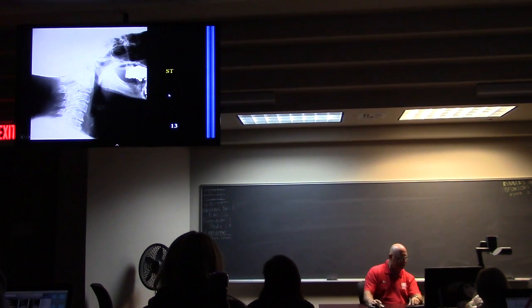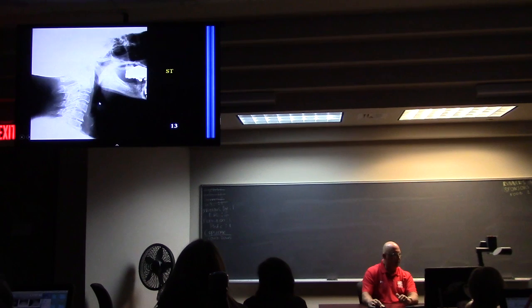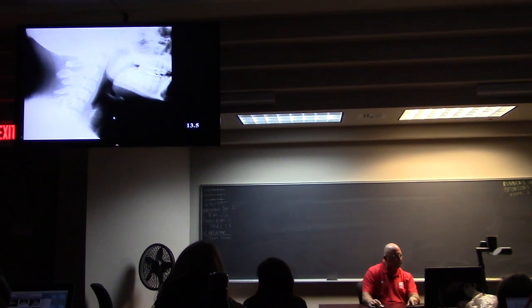Oh, I'm so sad we can't see this. This is a 70-something-year-old lady who came in with a sore throat. She had epiglottitis. You follow the tongue back to where it stops, and right there is a big thumbprint. It's really beautiful. I can't see it on my monitor. Can you see it? Yeah, vaguely. Yeah, that was beautiful.